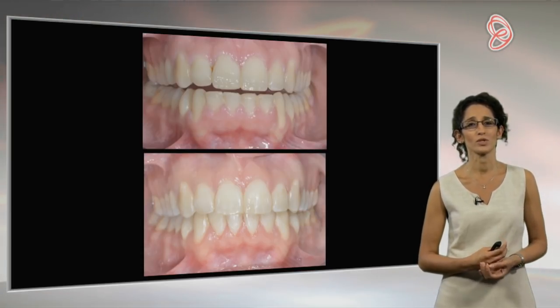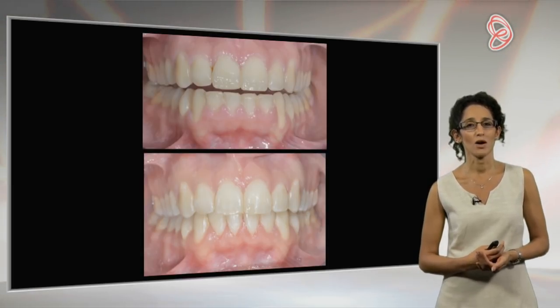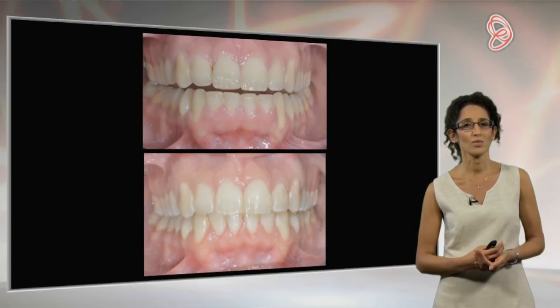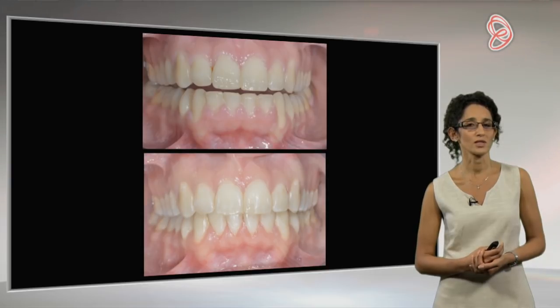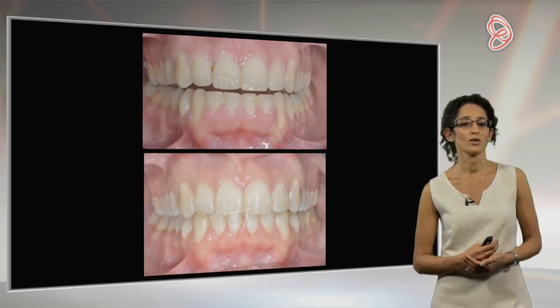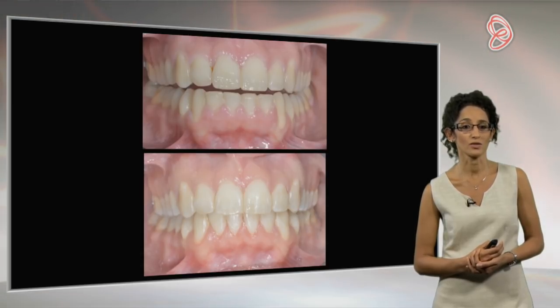But another thing we're able to do with the precision that we use with these lasers is you can see how I've really reshaped those papillae, so how I've recontoured them and flattened them off and thinned them out, which again is just something I couldn't do successfully with a scalpel blade, and certainly not do it and leave my patient in no pain or soreness straight afterwards. So he was delighted with the result.